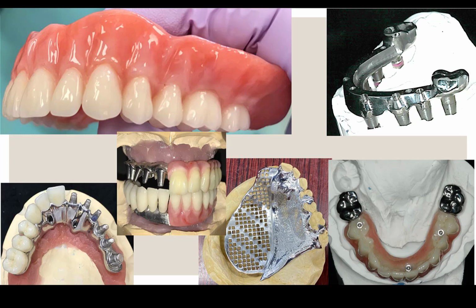Once your design is finalized and accepted by you and your patient, it can then be sent to Stoneglass for final milling and manufacture. It can be simple to more complicated frameworks to address the most challenging cases. Often models are not necessary to be sent, so the lab receives your case electronically in seconds.